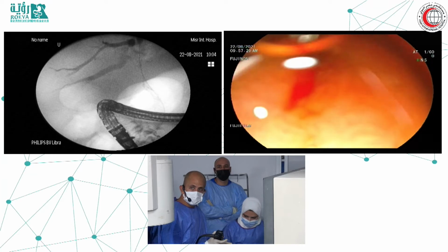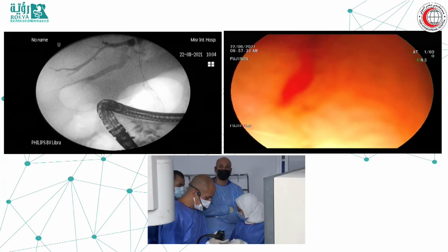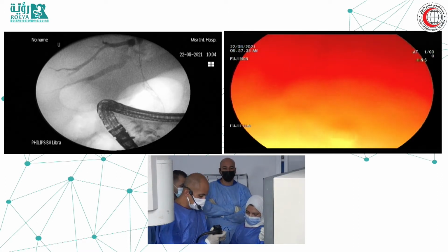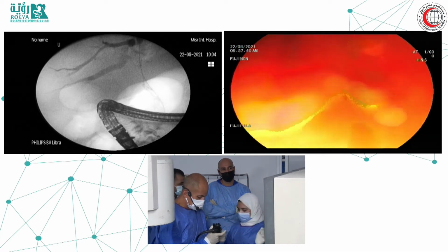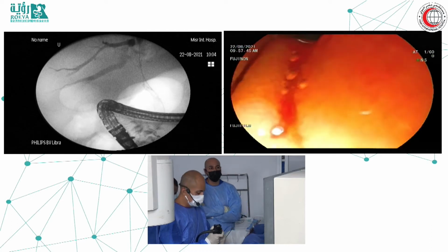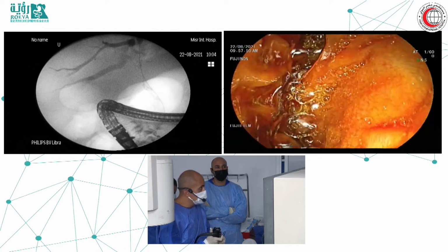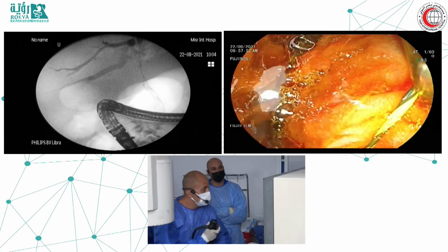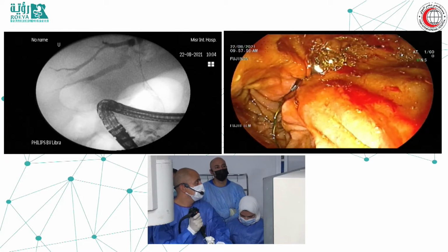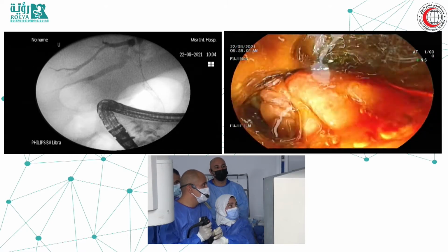When considering also the clinical history, I'm not so confident it is benign. This is my feeling. It looks like a very long stricture, right? It seems to be long, yeah. I think about 3 centimeters in length. It's affecting the common hepatic duct. If we would classify it, I would classify it as a Bismuth 1. I think that you do have a free bifurcation.